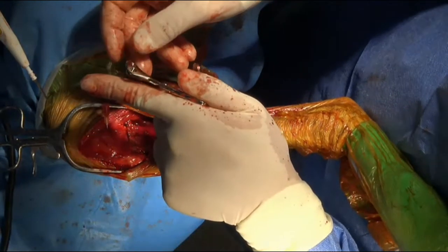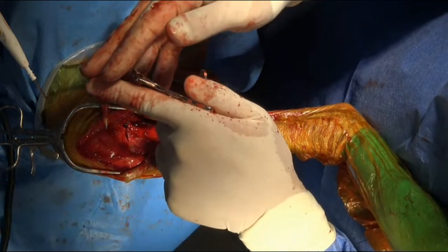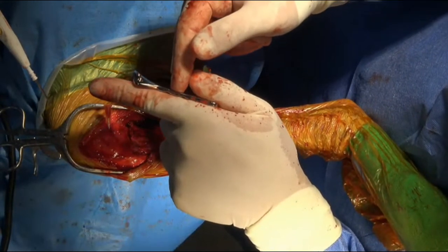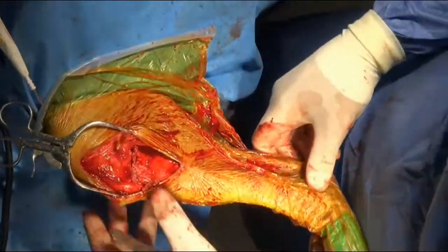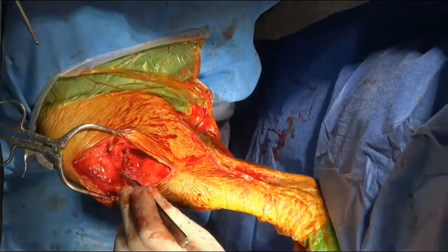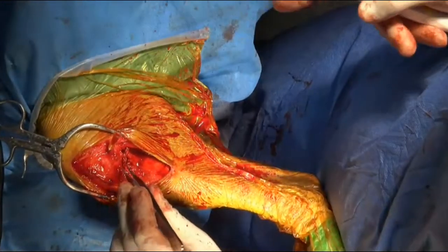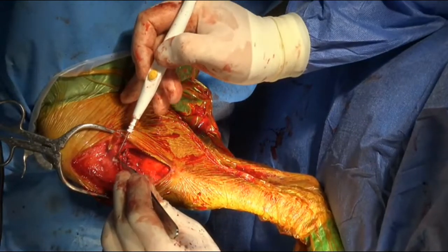And that's not ideal because if I put a cortical screw in here in a compression hole and I lock this top segment, as I tighten that compression hole up, it's going to want to force that proximal segment and try and create some translation and movement, which is not going to be ideal. So to get around that, I'm actually going to remove some of this buttress from this region just here.